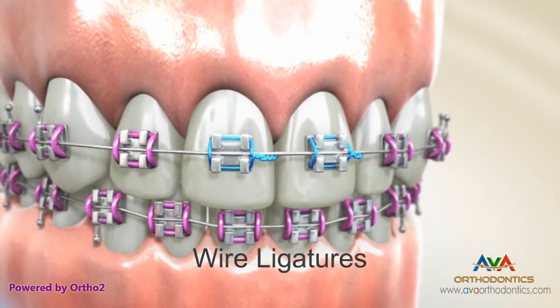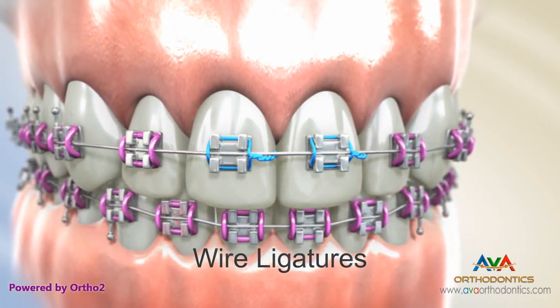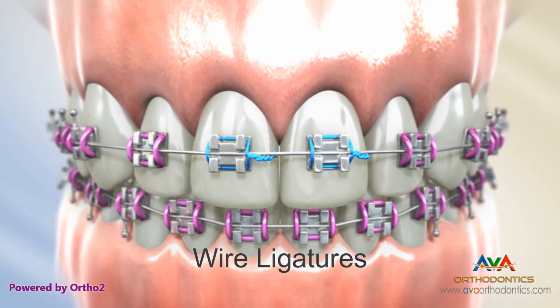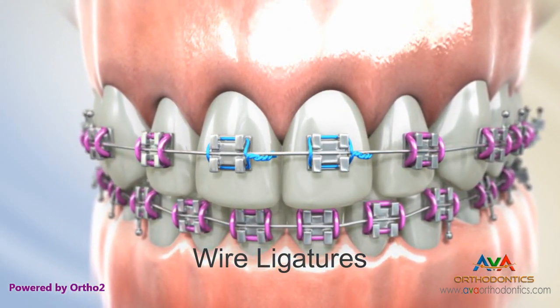Similar in purpose as color ties, a wire ligature's primary job is to hold the arch wire in place. The wire ligature can also be adapted to several brackets at once and can even be used as a connection point for rubber bands.